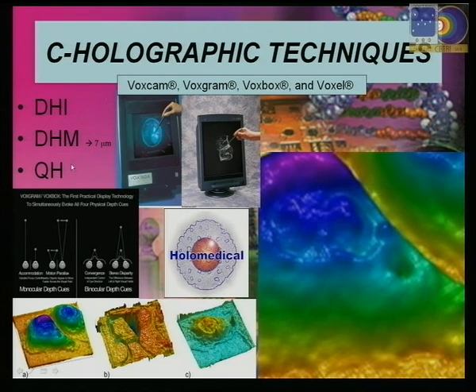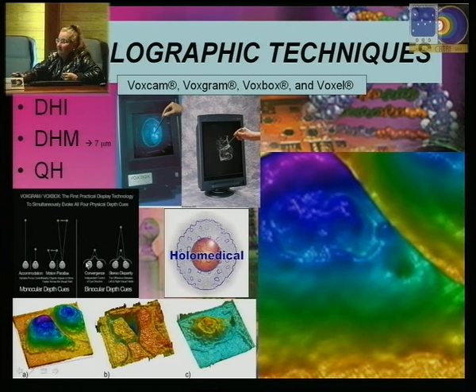What is interesting for some medical applications of holography is that you correct a lot of viewing problems of the area. So you correct for depth of the image, you correct for lateral deformation, lateral vision, and therefore in some areas, like for example in breast, or even when you are planning surgery in the spine, holographic imaging displayed on particular monitors such as this one could be of interest.